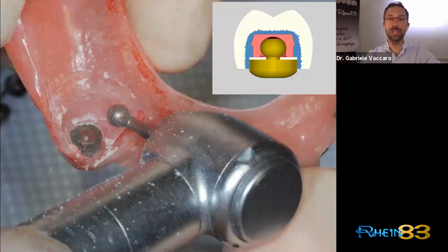After that, we finish and polish everything inside, because we don't want any contact between the resin and the root. Otherwise, we lose all the resilience of the gum that we said before. The resilience also is useful because it goes exactly in the same way as when the denture relies on the gingiva, on the gum: there is resilience over the soft tissue, and we have the same on the gummy green cap.